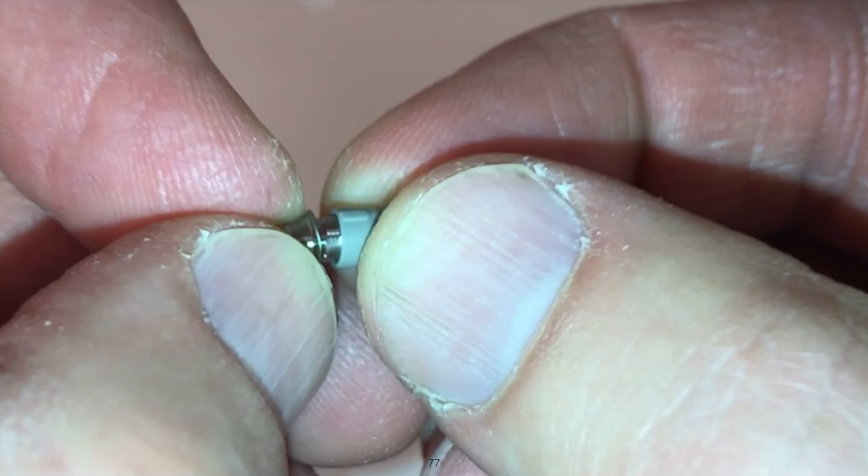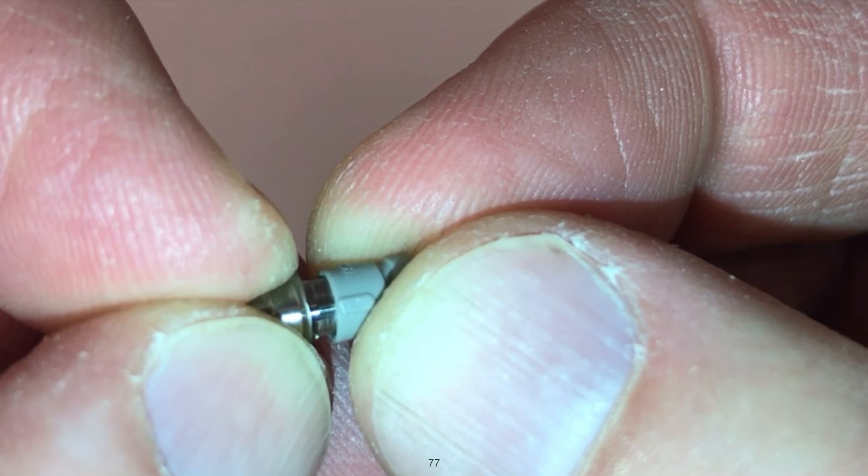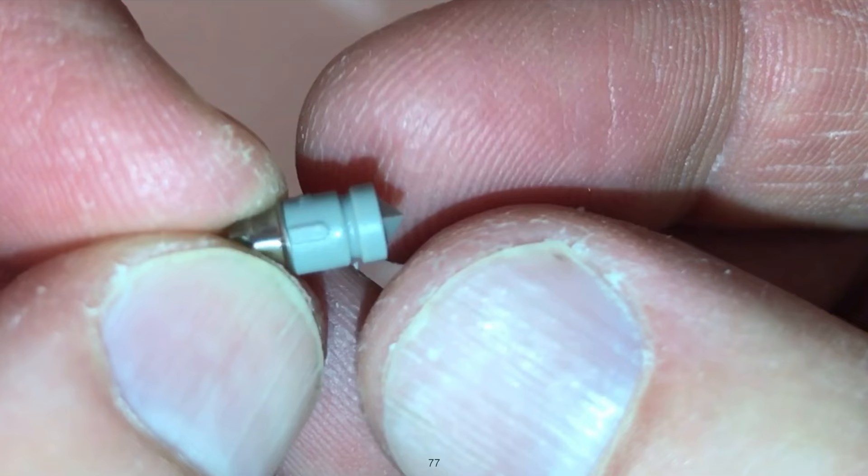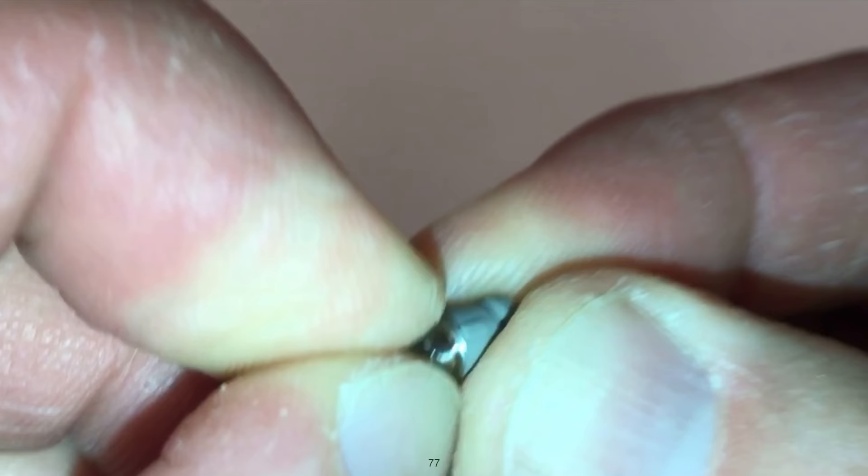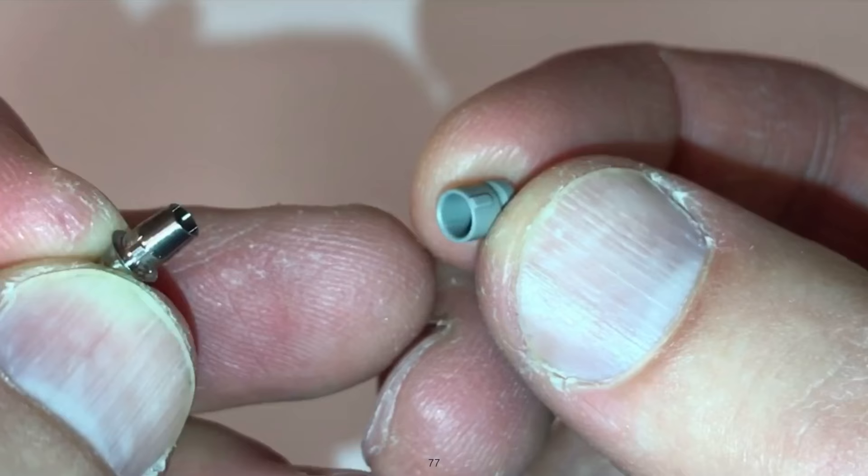This right here, putting that scan body on the tie base or the scan post, is the most error prone area in implant restoration in my opinion using the CEREC and the tie base, because people will get these off alignment and force it to place. Do this a couple times outside the mouth, make sure it slides together and you're comfortable with how it comes together. It has to be perfect. If you bend this scan body, throw it away, get another one.